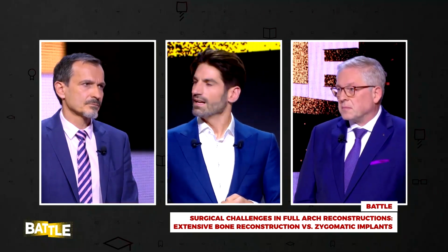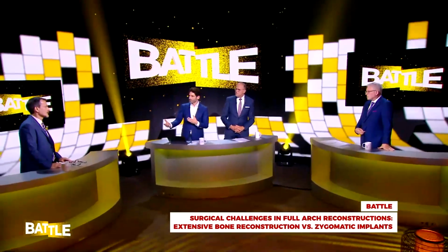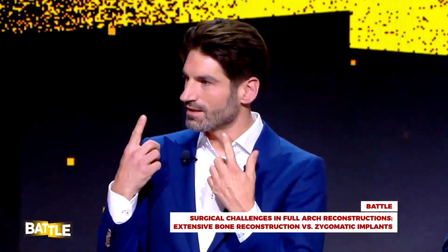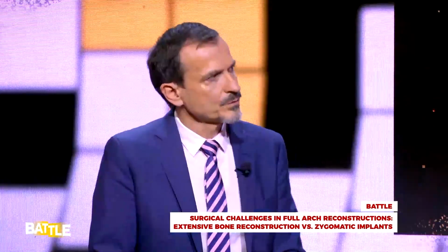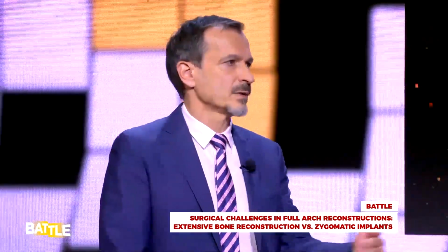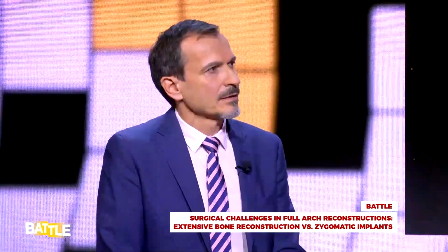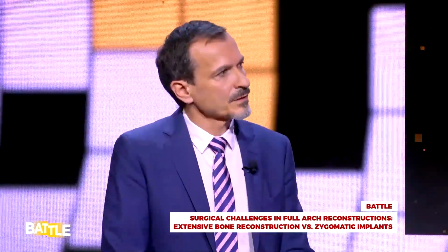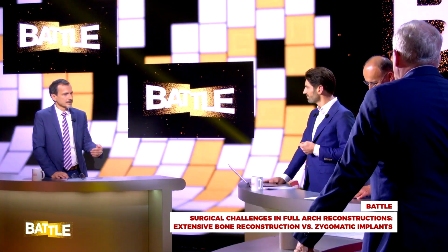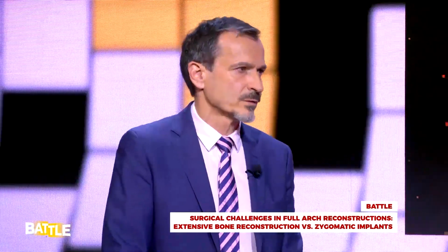Yeah. And when you say age, has that also to do with the durability of the solution, perhaps? Is there a risk involved that maybe after 40 years the zygomatic implants become a problem? Of course, we don't know yet. We don't have the data. These long-term data, we have data for about 10, 15 years, but not longer. But I still believe that if the implant is stable in 10 years, then it will also be stable in 20 years and 25 years. But we have to wait for the results.